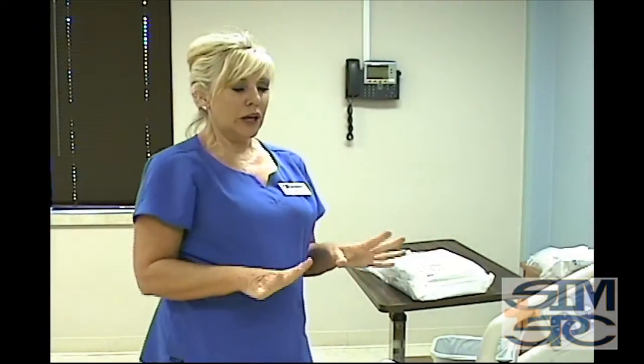When you walk into the room, you're going to introduce yourself and say that you're going to wash your hands. You'll ID the patient and let her know that the doctor's written an order for an indwelling catheter to be placed. Upon doing that, you may even ask the patient if they've had a catheter placed before. That way you know what she understands about it and what to expect. If not, you need to explain the procedure a little bit to the patient because that will take down the stress level of the catheter placement. Plus, you'll be able to maybe help and assist with it by holding her legs and knowing what she needs to do.